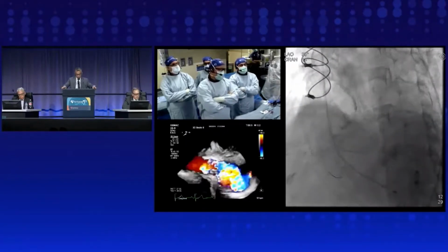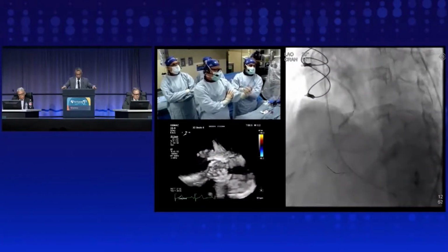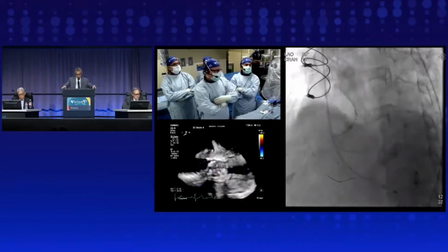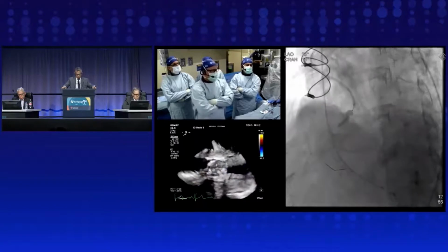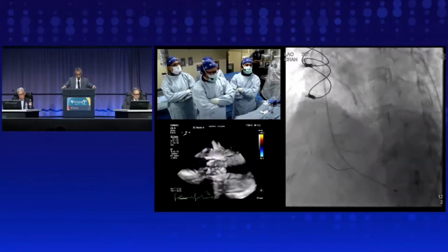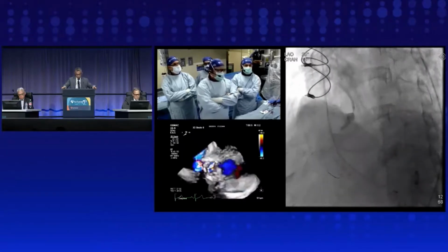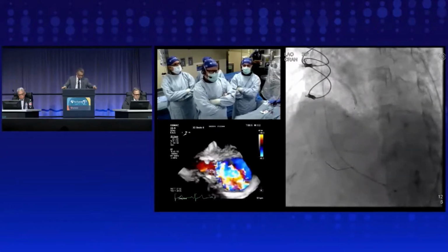Want to go back to that picture, Danny? Yeah. So this one has an anchoring balloon, which you put at the ostium, and then it has a bulbous balloon on the aortic side to help compress whatever part of the stent might be hanging out back to the aortic wall. So I think we got a really nice result with that, and we quickly moved on from there.